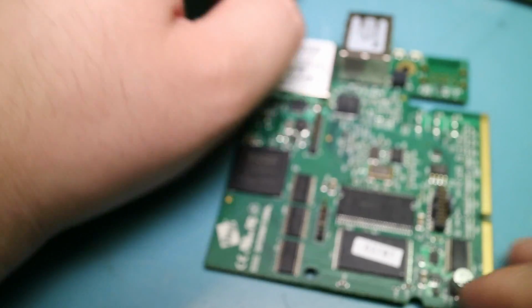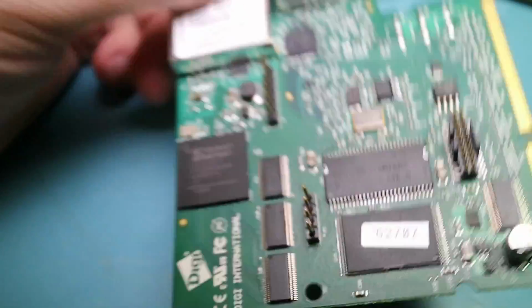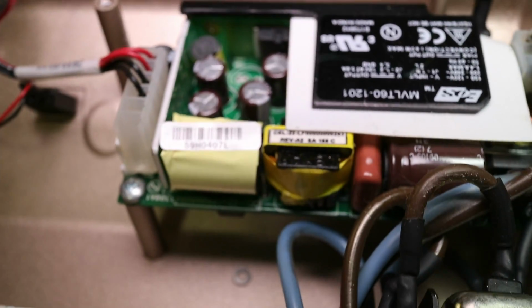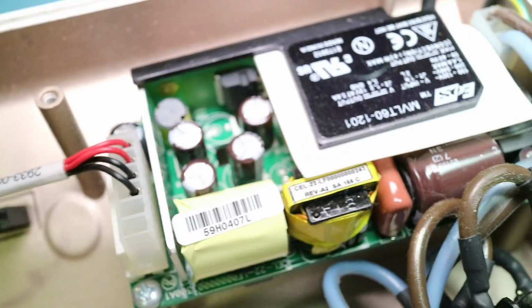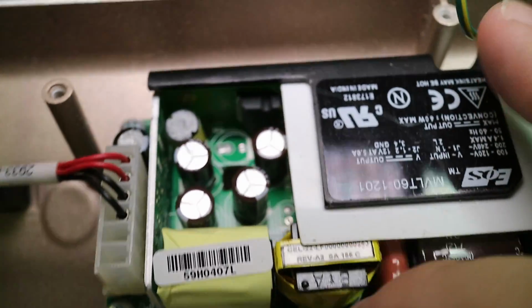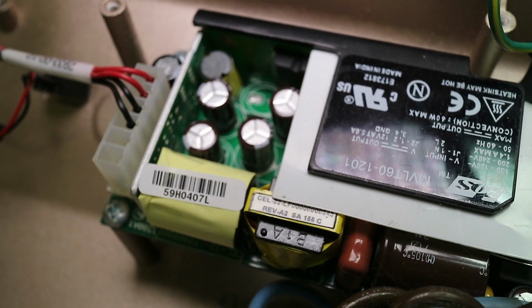And I mean, what are you going to do with this? It's low power, but just go get a Raspberry Pi. It will work just as well, if not better. Power supply, probably useful. I might just pull this out and keep it. It looks like it's in really good shape, and it's nicely made, lots of filtering and stuff. It's got two, I don't know if this is another inductor. It may have active power factor correction in it too. Very nice. So that I'll probably hang on to.